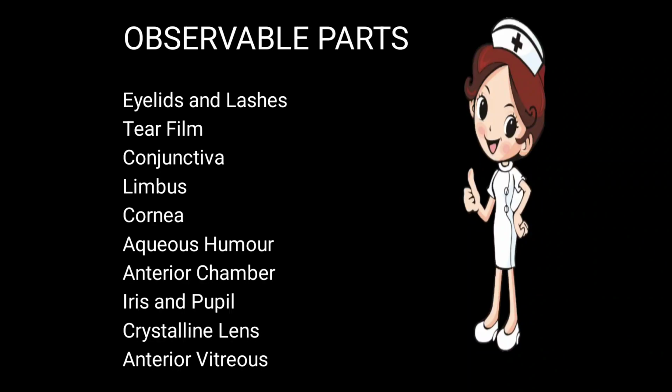Next one is the aqueous humor. We can examine the aqueous humor. Anterior chamber, the area between the cornea as well as the iris. Next one is the iris as well as the pupil. Iris is the colored part of the eye and pupil is the darkish black hole inside the eye. Next one is the crystalline lens. We can also examine the lens. Next one is the anterior vitreous. The outer part of the vitreous we can examine, and we can also use the 90 diopter lens for examining the retina.